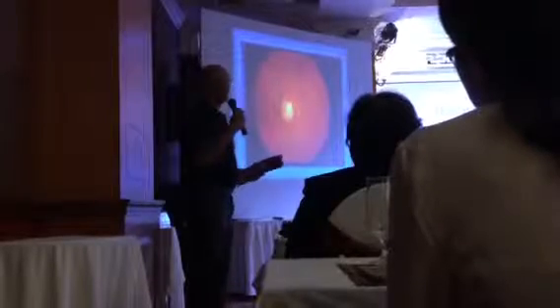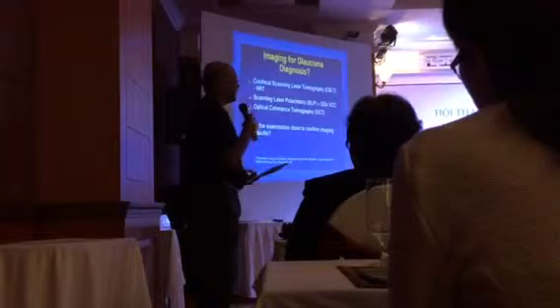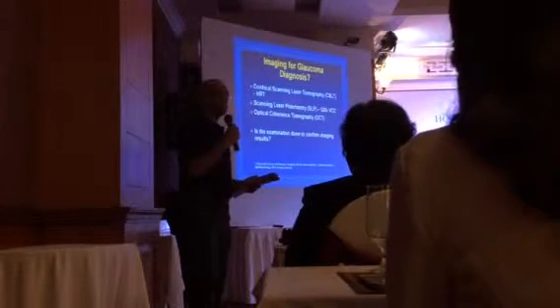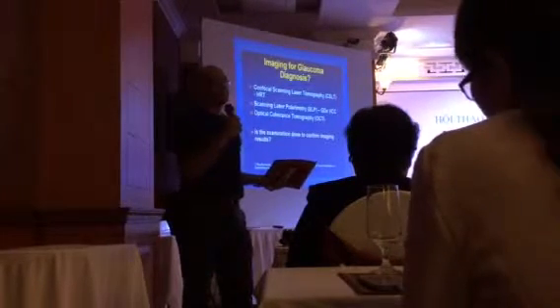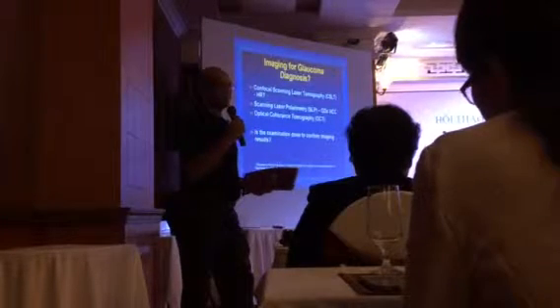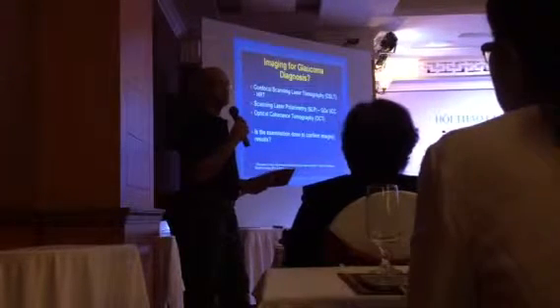But they can have subtle signs of glaucoma. So, as you know, there are many modalities for imaging glaucoma. They're all very good. We certainly can't practice modern ophthalmic practice these days without it. Imaging is essential, and it's a very valuable tool.